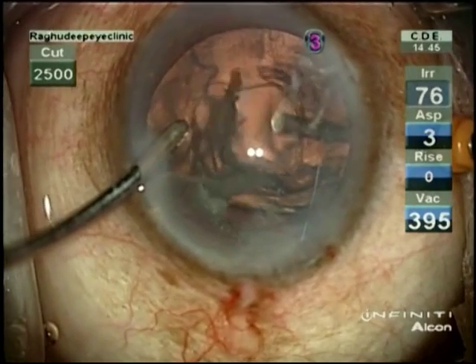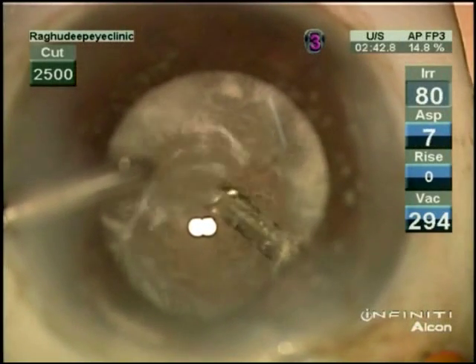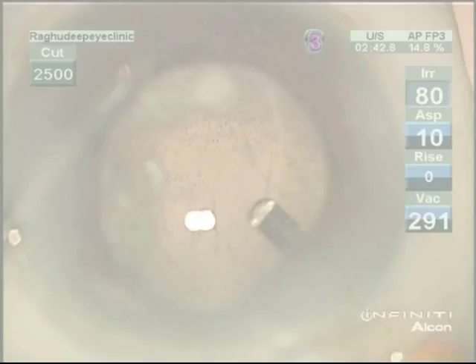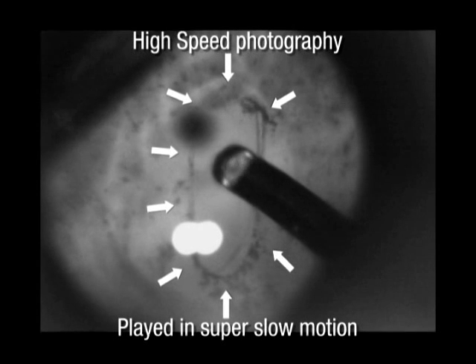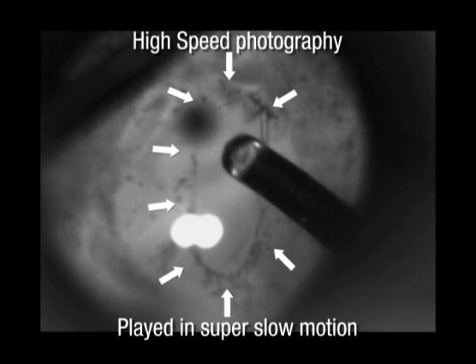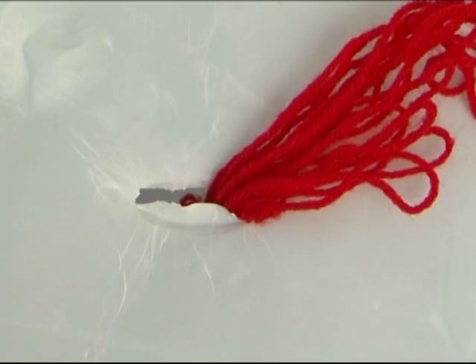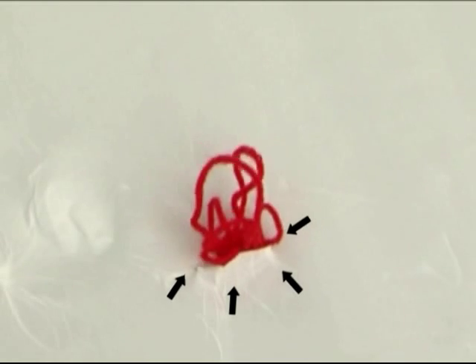So let us understand why the pars plana approach serves our purpose better. When we manage the prolapsed vitreous from below, we are essentially draining a smaller volume of the vitreous through the PC tear. This downward drain also causes less turbulence and less pressure on the posterior capsule. And it is this which keeps the tear margins more stable. For easier understanding, look at this illustration. Imagine that the red wool is a prolapsed vitreous in the anterior chamber. When pulled from below, it slips back without causing any tear enlargement.